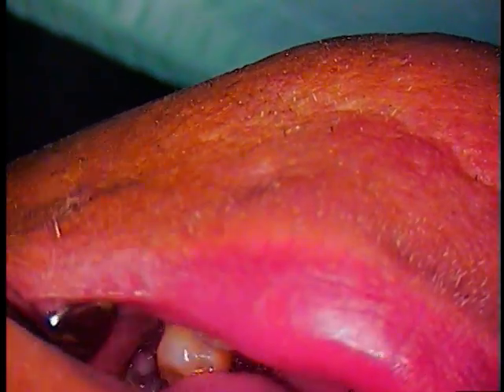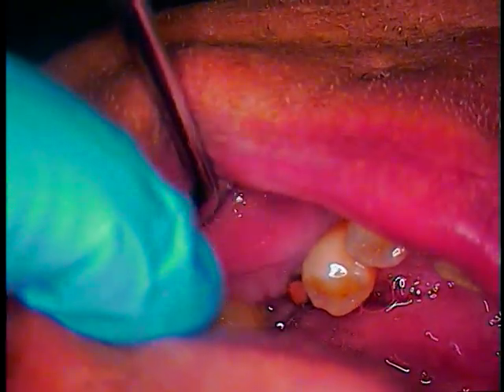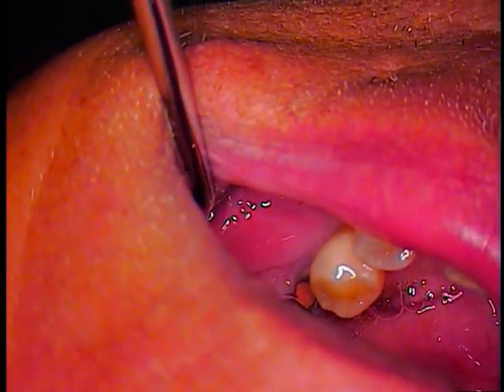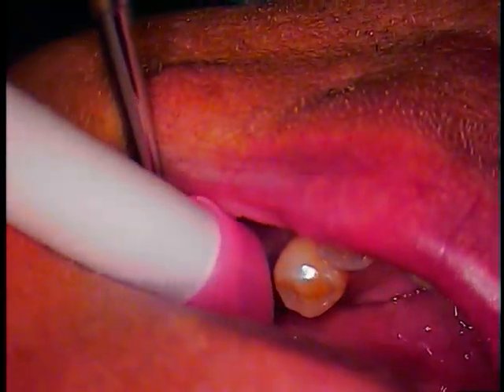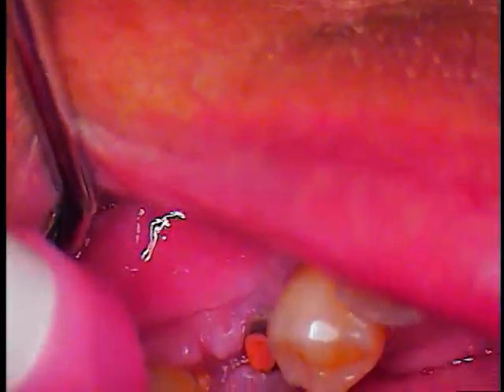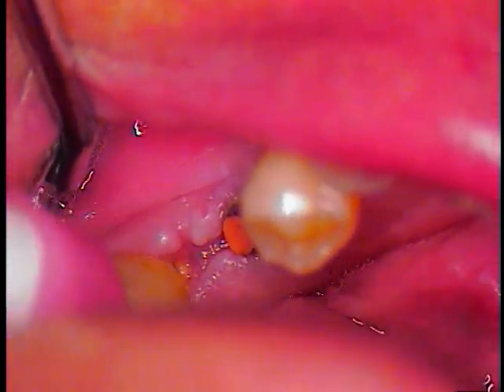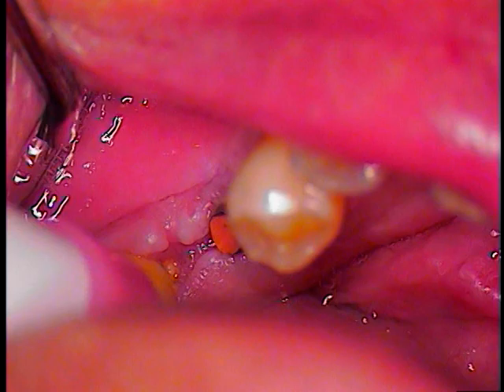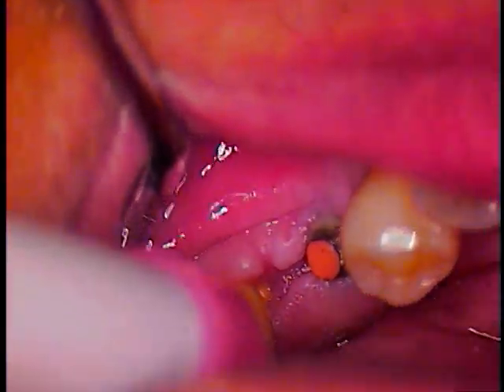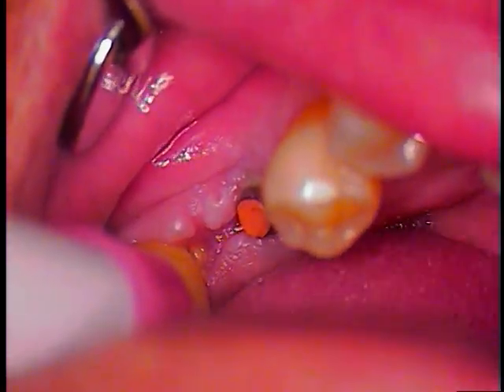We're going to have you retract with the mirror. Let me know if I'm bothering you at all. We're going to come in with the suction — I'm just going to remove some of that saliva. Turn a little bit toward me, please. So here's part of the discovery.